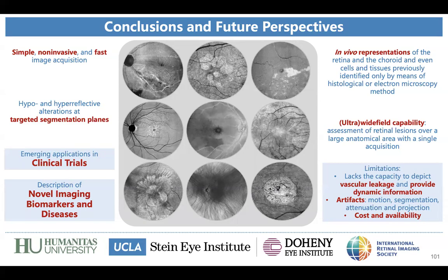To the best of my knowledge, usually the agreement is not so high across different software and devices. And also this type of artificial intelligence system performs well, but not yet at the level of an expert physician, of course. I think, and this can be my opinion and my experience, that the best they can achieve is around 60 to 80%, not more.